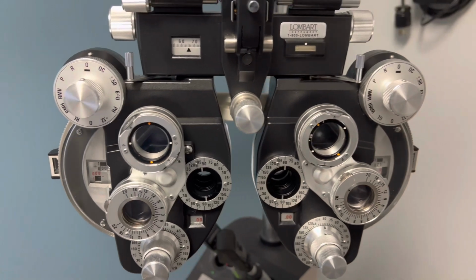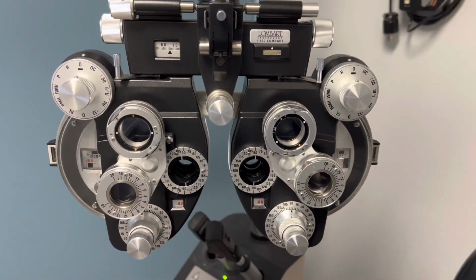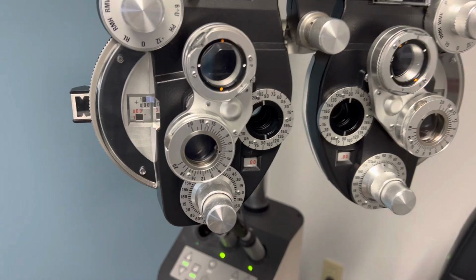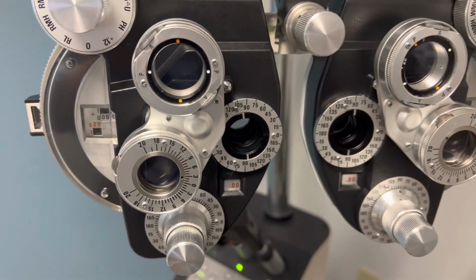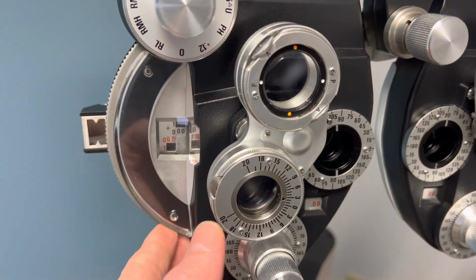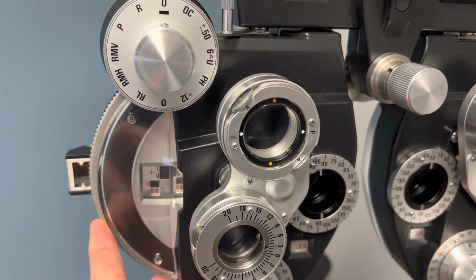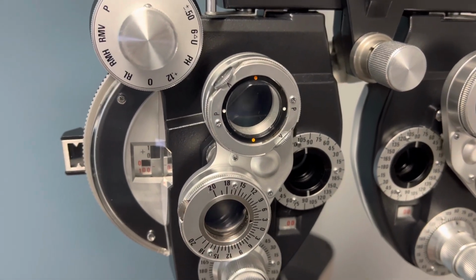So this is called the Phoropter. And when we are determining what your glasses prescription is, we are doing what's called a refraction. And to determine what your prescription is, we put your prescription into these little dials here. So for this example, let's say your prescription is a -1. So I'm going to turn this to a -1. You can see the red numbers. The red numbers indicate minus, and the black numbers indicate plus, which means you're farsighted.